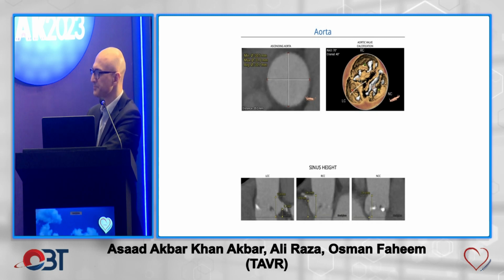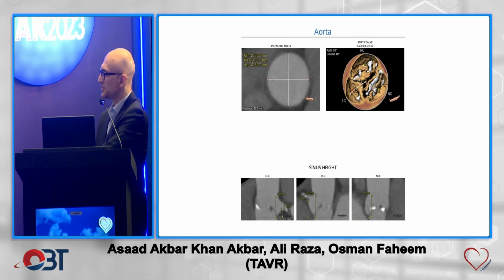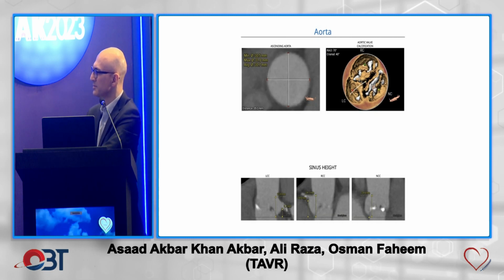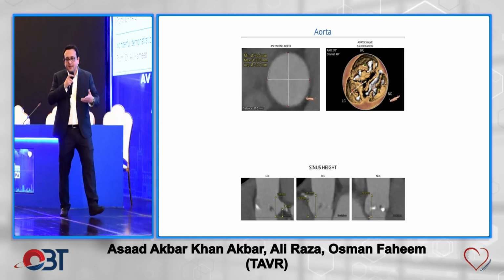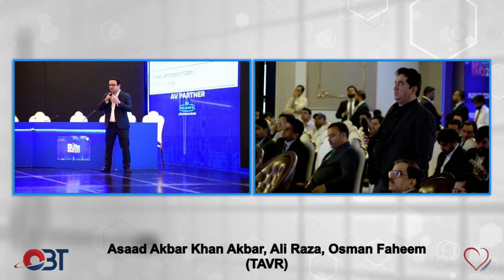Just one excellent, और यही that was my point as well. So once you look at this leaflet, तो फिर अगली चीज़ देखते हैं इस leaflet की calcification कितनी है. हाँ, if it's all heavily calcified, तो what you're assuming is that it will keep standing up once the valve is implanted here. Whereas a soft pliable valve like this will probably fold down and fall under gravity as well. Exactly. So if you have room in the sinus, it will fall. But if it is calcified, everything is tight, so again that's a consideration that you might end up with a coronary occlusion.